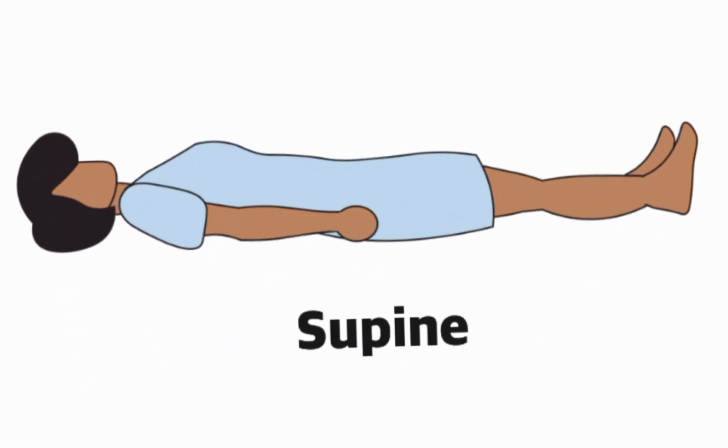If the bladder is over-distended, in other words too full, it appears round and is very difficult to scan. If the bladder is not adequately distended, in other words under-distended, the normal uterus also will be difficult to visualize due to interference from overlying bowel gas. In patient position, the transabdominal exam is performed with the patient in a supine or recumbent position.